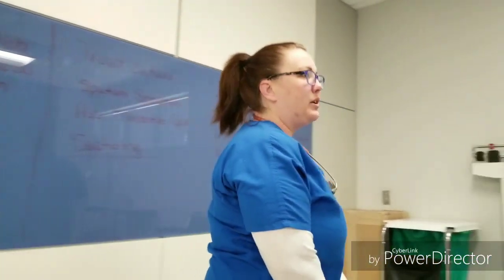My name is Brandy. I will be performing respiratory skills for you today. First off, we're going to administer a nebulizer treatment. I've already checked my orders and gathered all my supplies. Now I'm going to verify my patient.